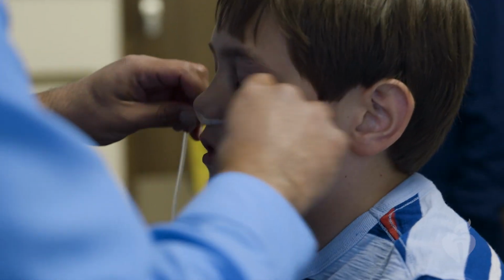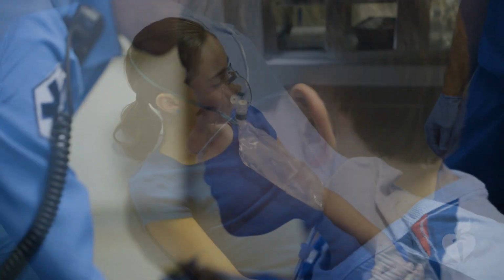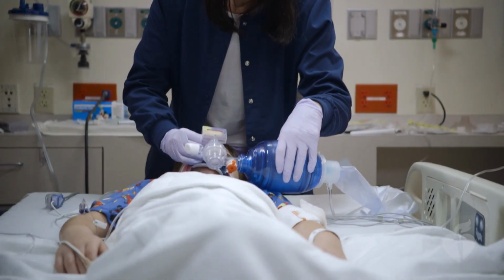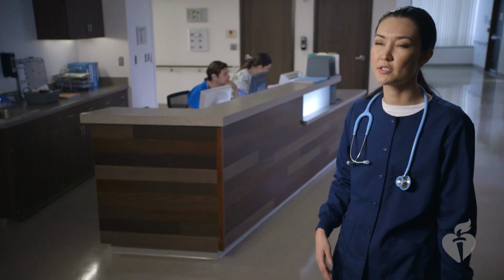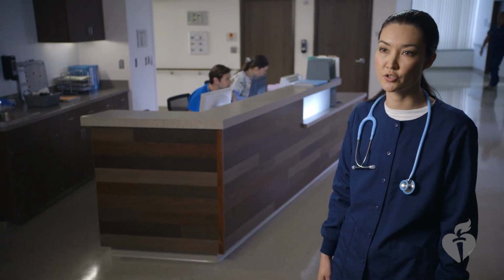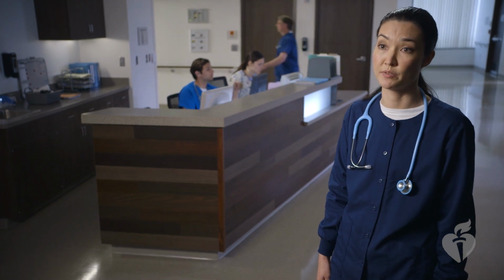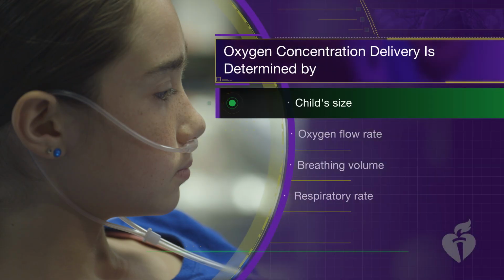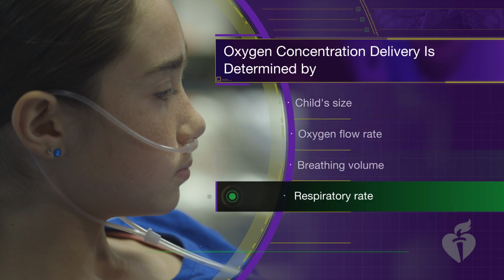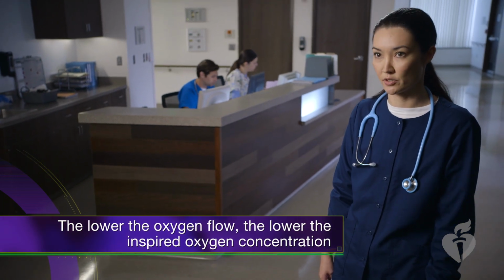You may choose to use several types of oxygen delivery devices, depending on the severity of the child's condition. Now, these devices vary in the oxygen flow rates used and delivered, and in the oxygen concentration delivered. You'll want to use low-flow oxygen systems when a child requires a relatively low inspired oxygen concentration and is relatively stable. These systems deliver oxygen mixed with room air during patient inspiration.